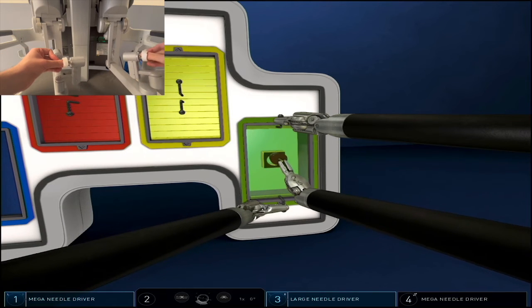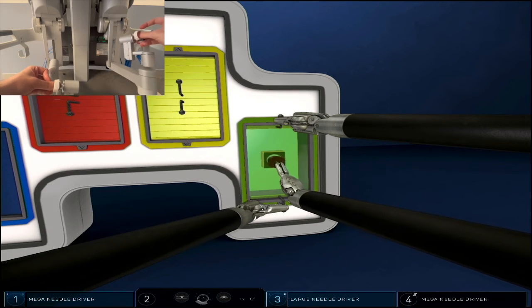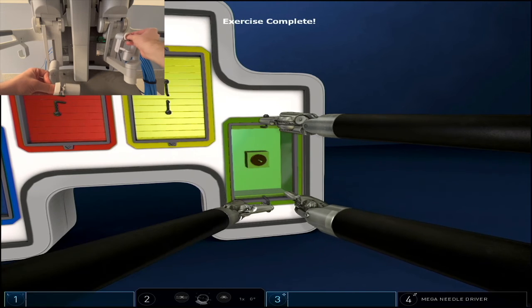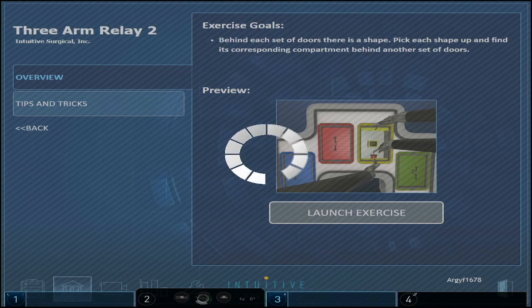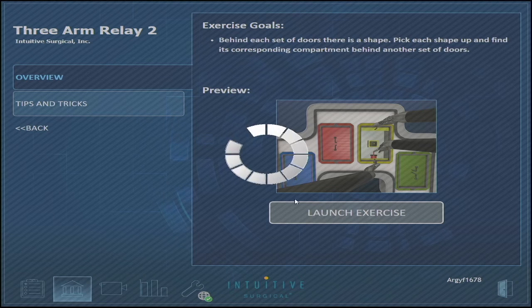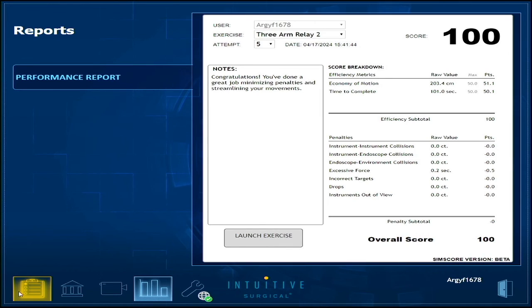The exercise might subtract points from that as it delays the overall exercise and you lose points from fluency. That's all, thank you.